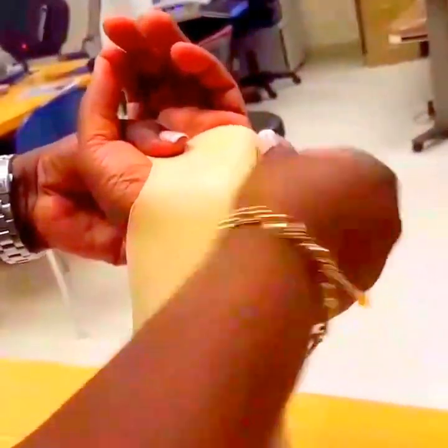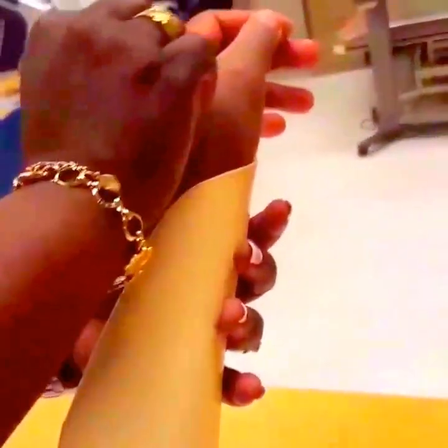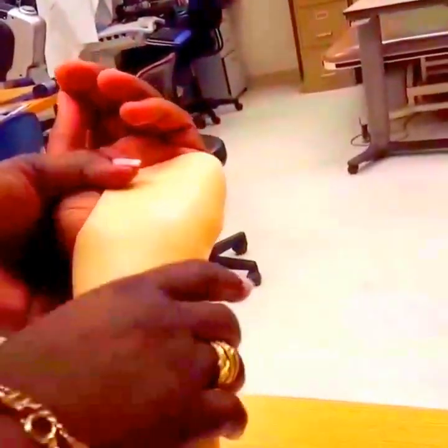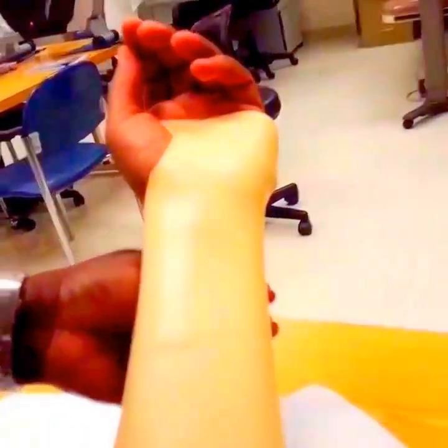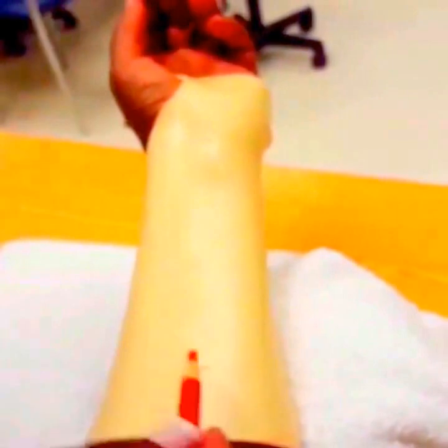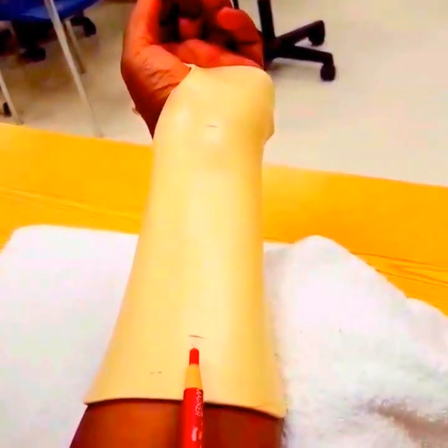Make sure you actually mold it on. Have the patient turn the hand over — you can see that it's midway up the trough and the bar does not extend beyond the second digit. The next step will be to double check for fitting and any sharp edges, and if there are any, go ahead and smooth those out. Before you put your straps on, put a few marks to indicate where you're going to attach the straps — you'll need three: one for the proximal end of the forearm, one for the wrist, and one at the distal palmar crease.